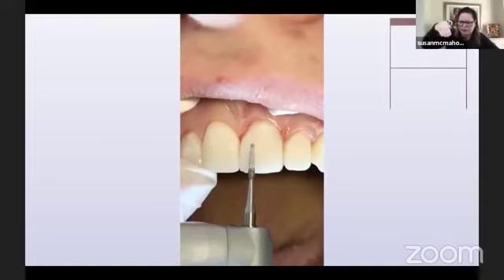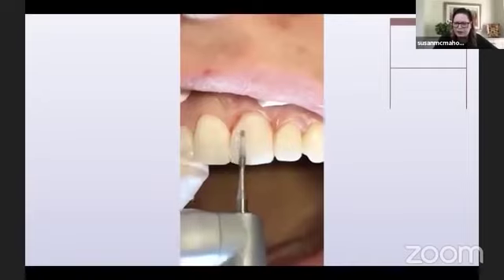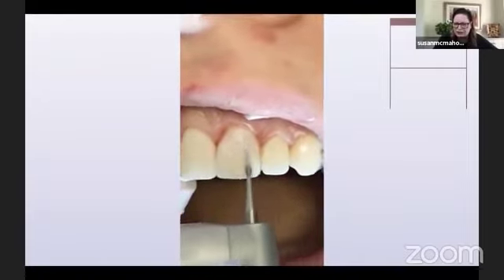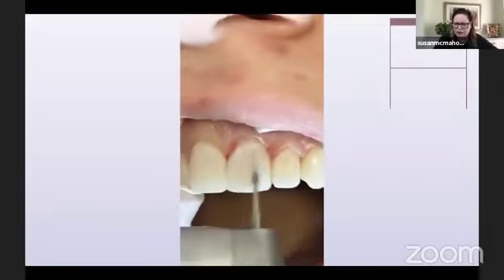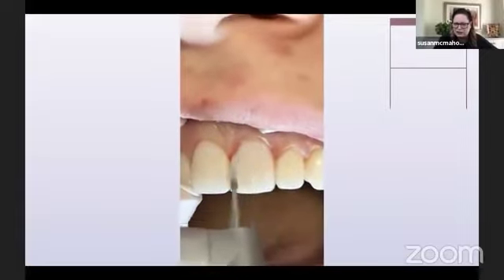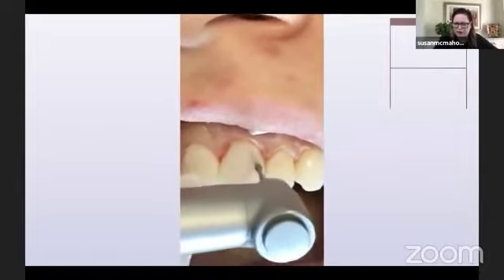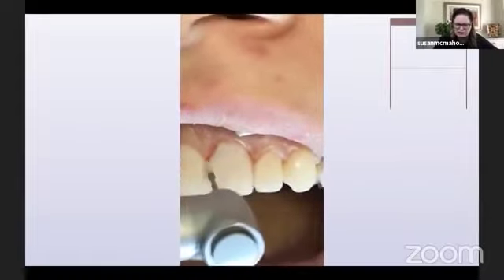And then I'm going to flip that burr over and I'm going to go back and forth across the cervical to get those lines that we talked about. So we're going to go back and forth over the whole surface. I'm putting the lobes in and then back and forth over the whole surface, and flip it back and forth, back and forth, a bunch of times.